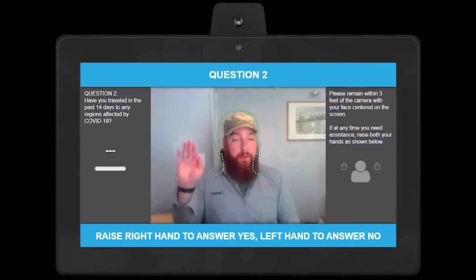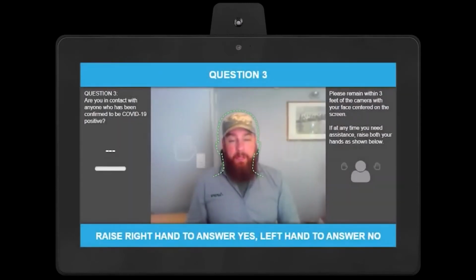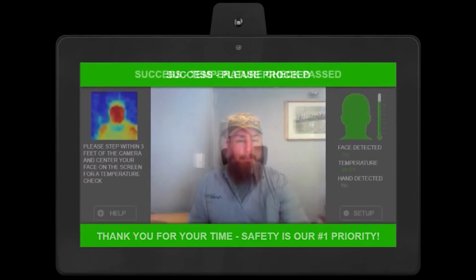Have I traveled? No, I haven't. I'm going to answer no to that. And finally, have I been in contact with anyone? No, I have not. And you'll see once I've answered the questions, I've passed the temperature check, we get a success, and I can enter the facility now.